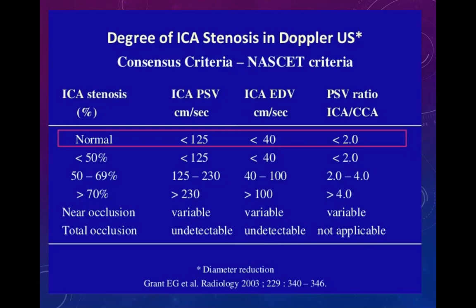So an institution will have a calibrated machine of its own. That is what he meant at that time, that it's an institution-specific formula and specific things that should be followed for the correct estimation.